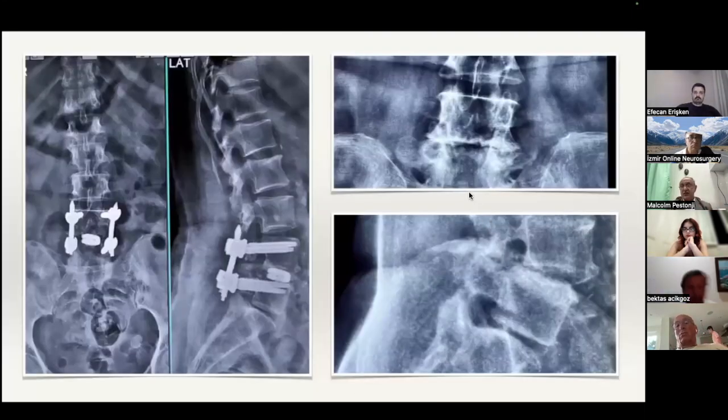See this patient, old patient of mine, old laminectomy done many 30 years back, comes back. Not good. What did we do? We took a Para-UBE approach, extreme lateral approach, beautifully entered in, put in the cage, did everything, completed it.